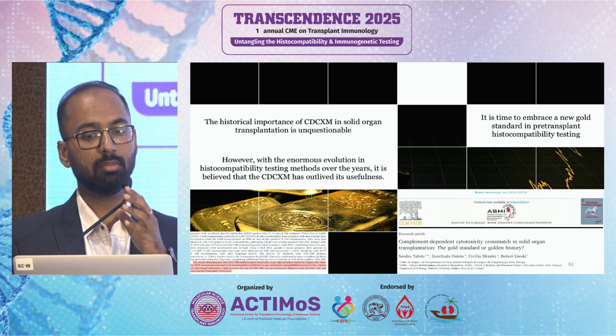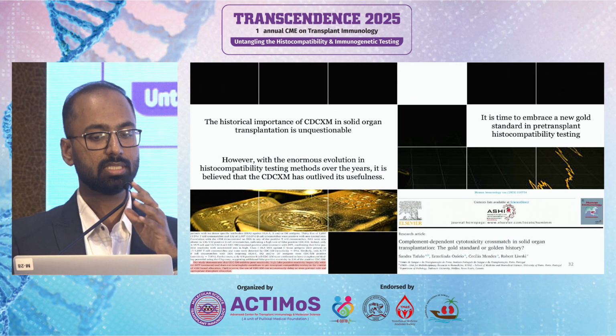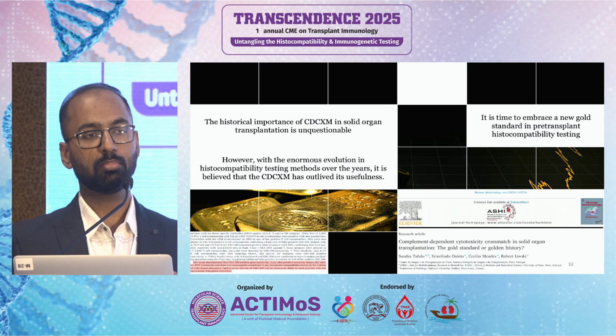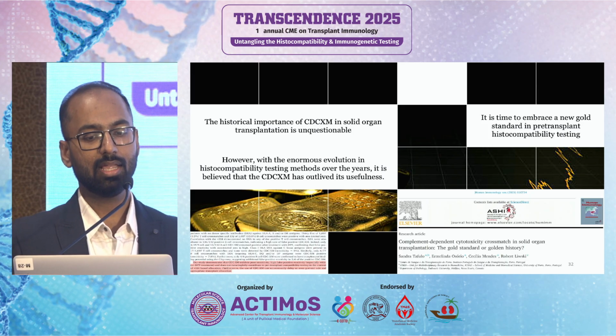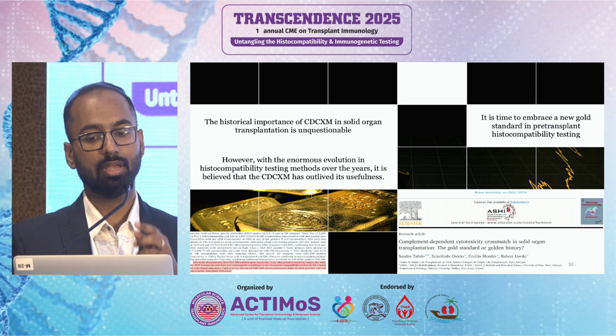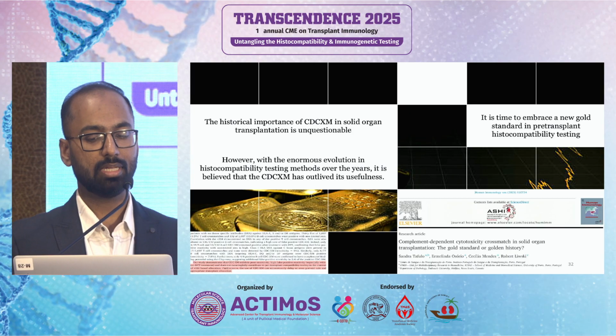The historical importance of CDC in solid organ transplantation is unquestionable because it is the best test to predict hyperacute graft rejection. However, with the advancement of techniques like flow cytometry and Luminex-based assays, we have to consider whether it has outlived its usefulness and whether we have to embrace a new gold standard in histocompatibility testing.